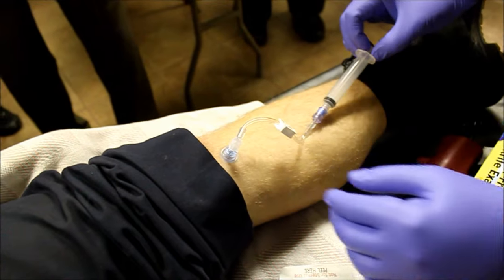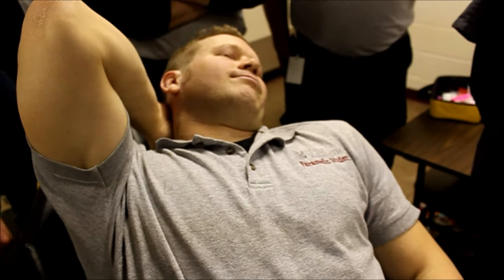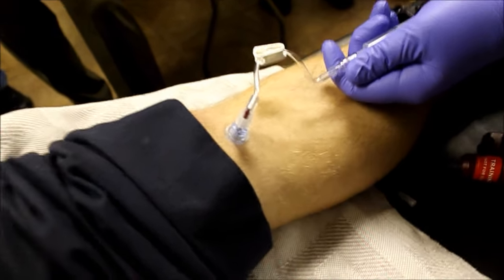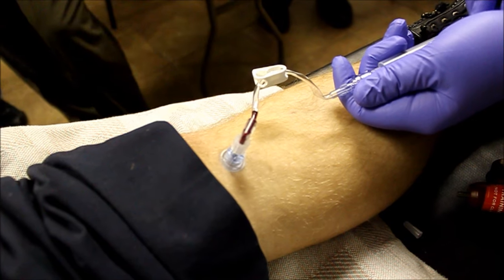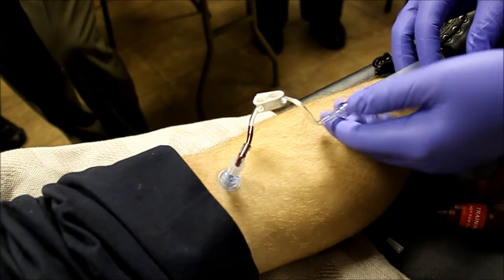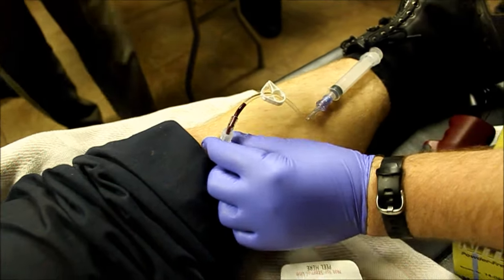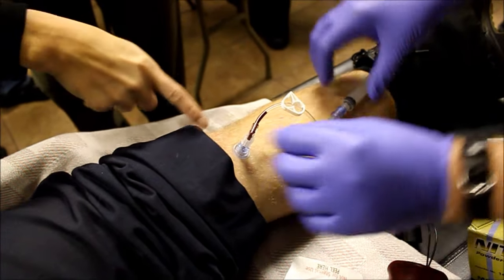Now, one other way is to aspirate slowly — really slowly — and you'll get venous-looking blood come back into the tubing. It might hurt a little bit. Deep breaths, brother. Oh, there it is. Does that hurt? I can feel it. See that blood, guys? We can send that blood off at the hospital for labs. You don't get as much blood out of the tibia as you can the humerus — I can get 10, 20 cc's out of the humerus most of the time. But the first cc or two — don't flush it back in. Don't flush it back in. So that's a great way of verifying you're in the right place.